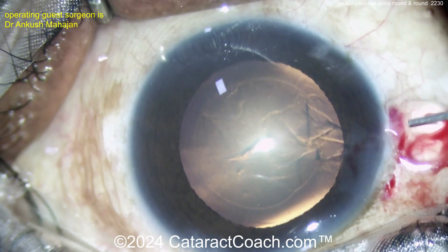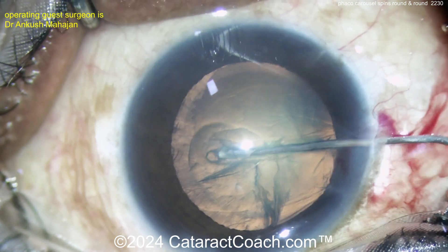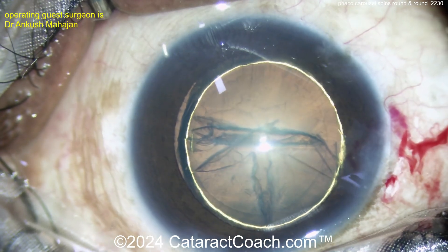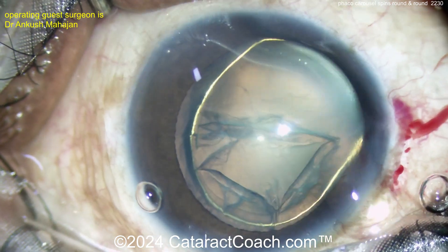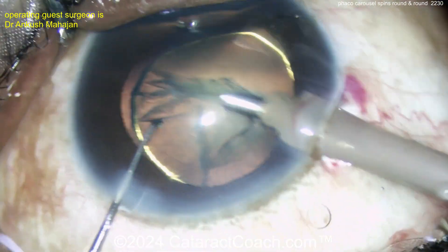And some hydrodissection here — that's key. The nucleus has to be freed up from the capsular bag in order for it to rotate. There's a little hydrodelineation. You can see the golden ring of hydrodelineation separating out that endonucleus. A little more viscoelastic going in here, covering the cornea too. It looks like HPMC, hydroxypropyl methylcellulose.